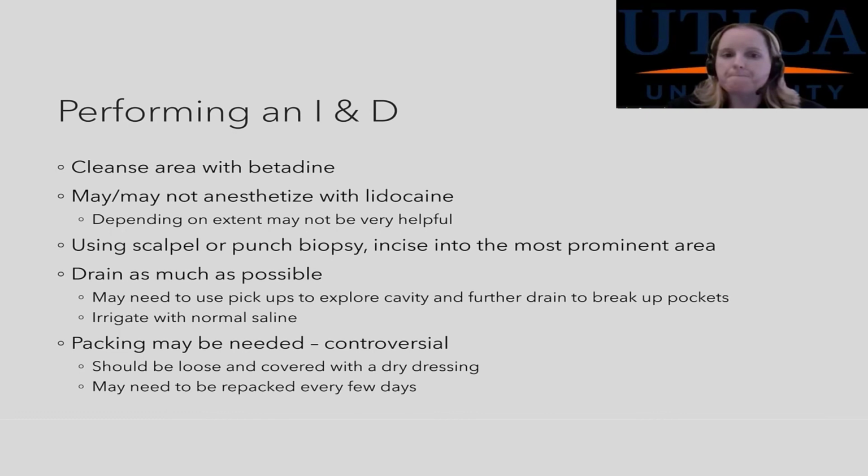The other thing, especially if you haven't done these before, this is my suggestion: take a large gauze pad and put it over your scalpel. Because sometimes when you incise, it will squirt across the room. I've had students with me who didn't do that and they got covered all down the front. So just keep that in mind. And sometimes it does not smell pretty. So keep a gauze pad over your scalpel because it will sometimes go everywhere.